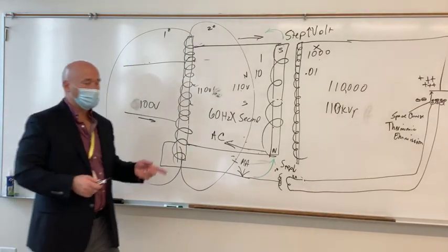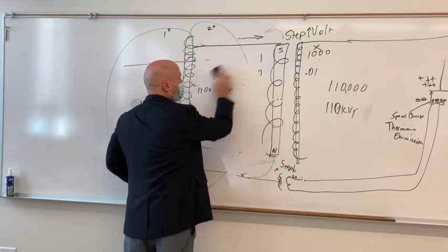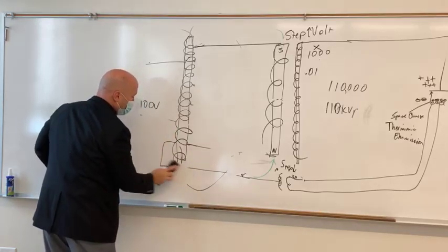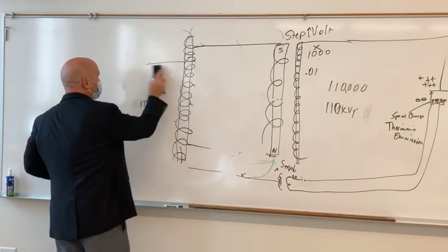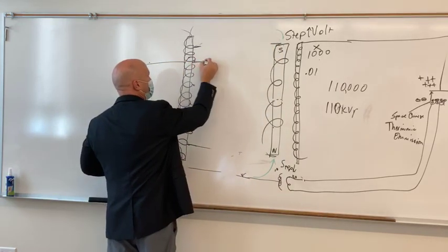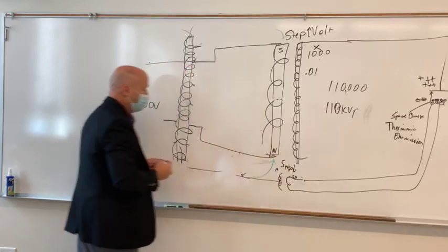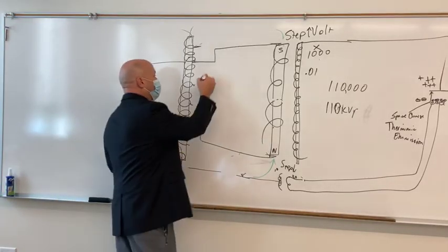Now, we're still going to have some problems with it. And we're still going to have some loss. Right? So I've been drawing this as if to say that if we plug in directly in the same spot on the opposite side of the magnetic field, then we're going to have exactly the same voltage, right? That's what I've been telling you. I've been lying to you. It doesn't happen that way. All right? You're going to have some loss. You get loss for three different reasons. All right? One is that you've got resistance in the wire.